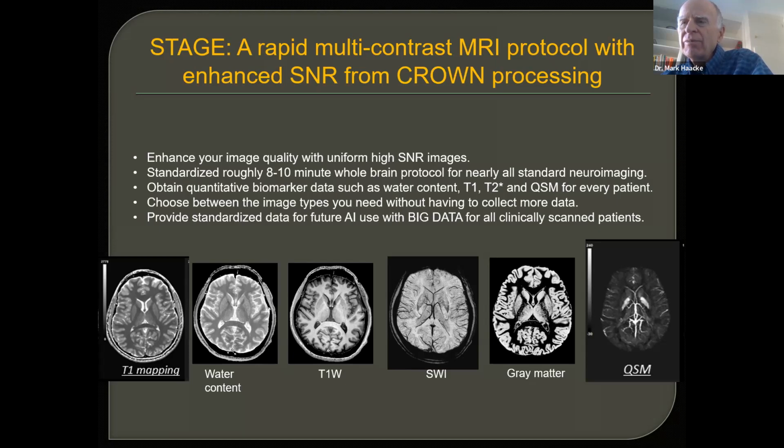And so some of the images that we acquire here at 3T are shown at the bottom, highlighting the different contrasts that are available with this type of technology.